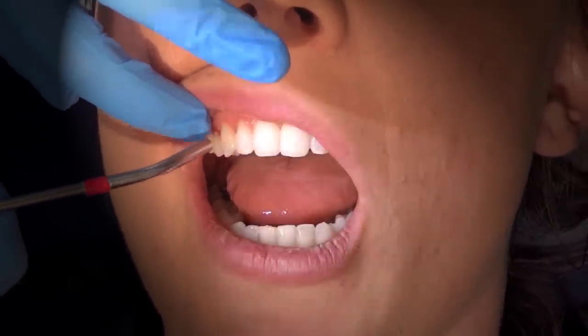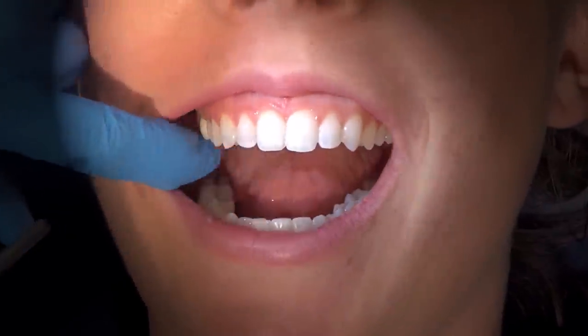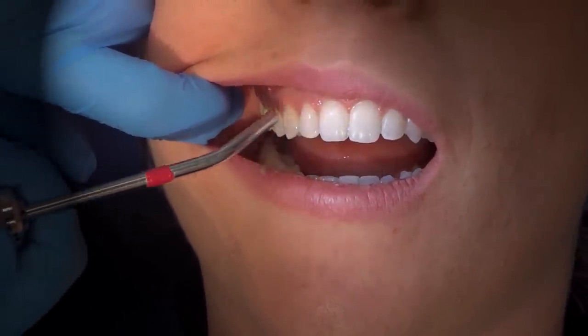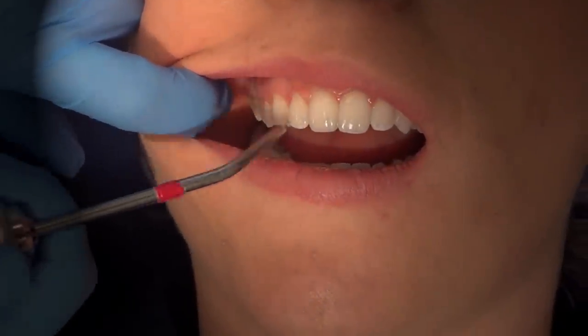You never want to do a blast spray — that's very rude. Instead, I'll point it away and start a little bit of airflow, then bring it into the area and spray the air nice and slowly.